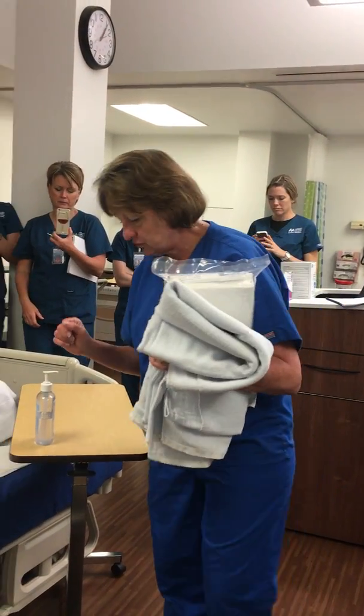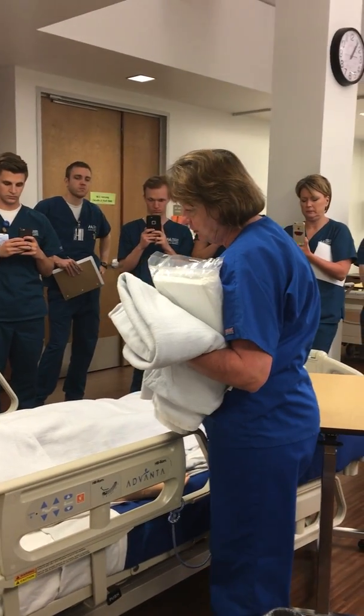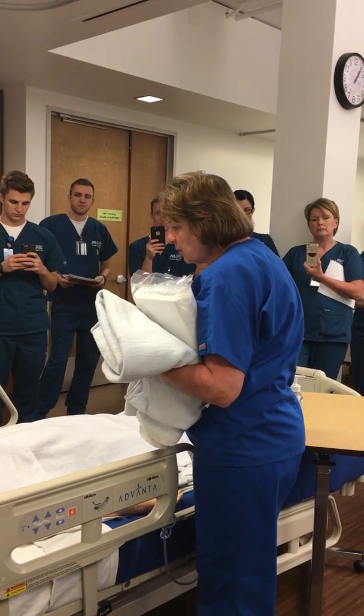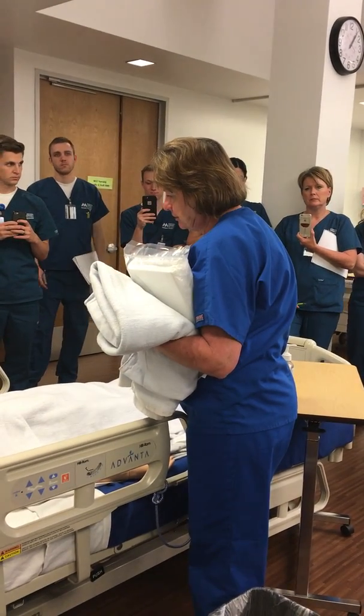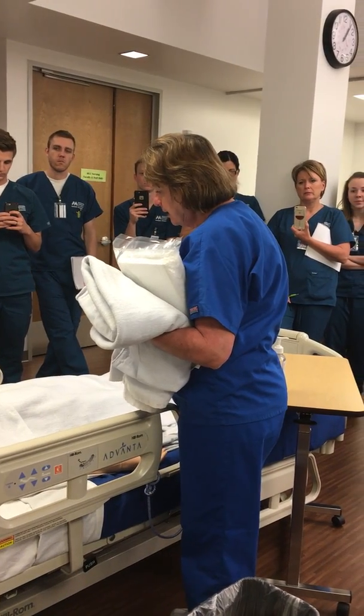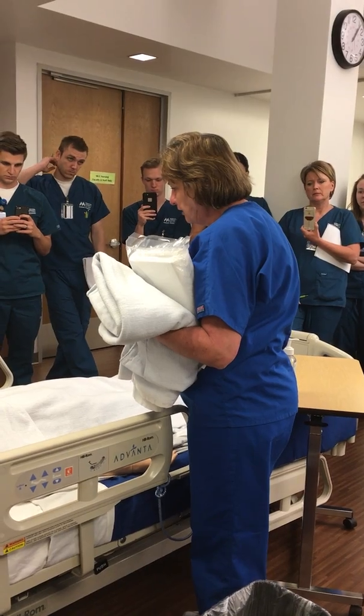Hi Mrs. Bellman, I'm Kathy, I'm your student nurse today, and I have to put a catheter in. Have you ever had one of these before? No. It's a tube inserted into your bladder to help it drain the urine out. You'll feel a little pressure, a little uncomfortable while I'm placing it in, but after that you shouldn't feel any pain or anything like that.